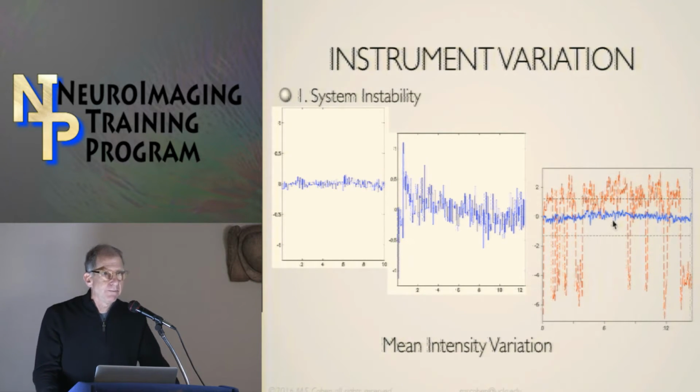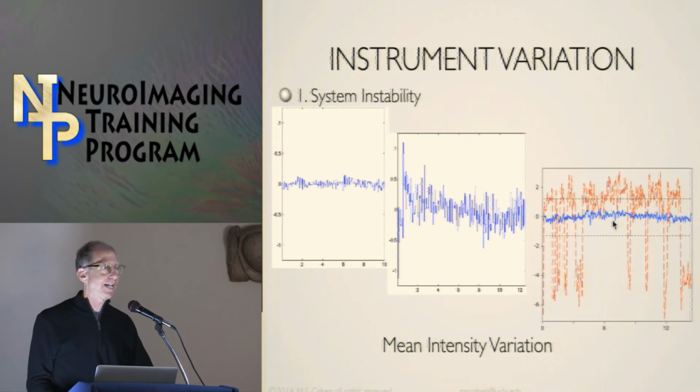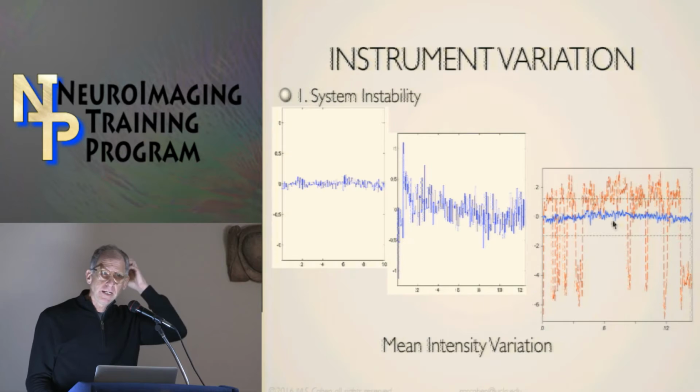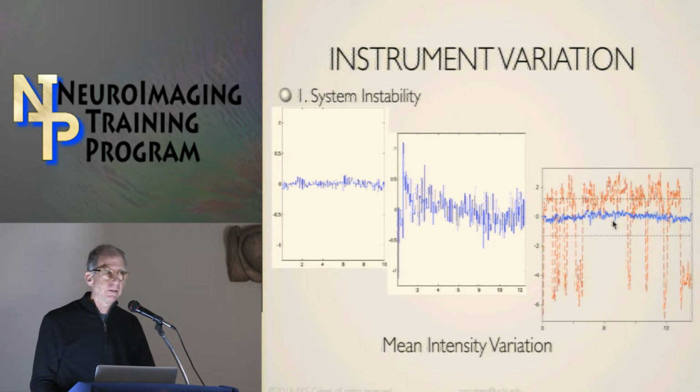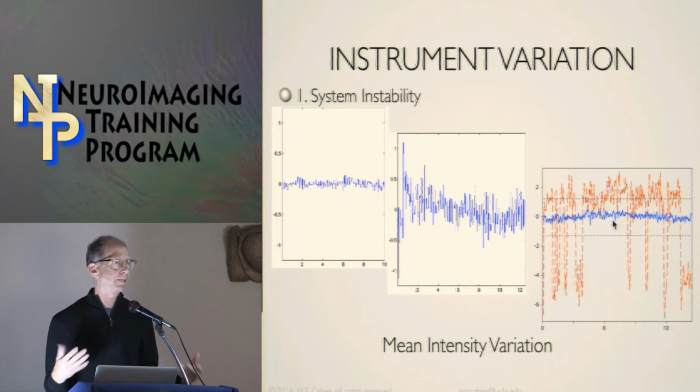And so the amount of sterility you have to apply in order to get good, clean connections inside and outside of the room is extreme. In my center, we are exceedingly fastidious about this. I'm sort of a tyrant when somebody wants to come in and hook up a new device. Anybody here see me in my tyrant mode with that? Probably. People just turn around and say, I'm just going to plug it in and do something or other. You don't think about these things.